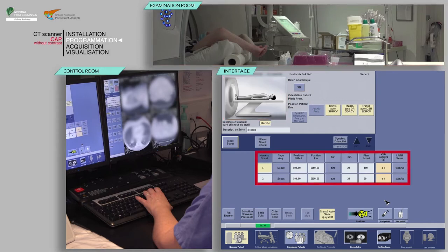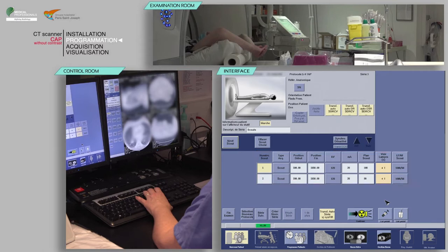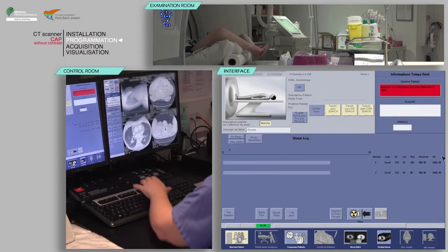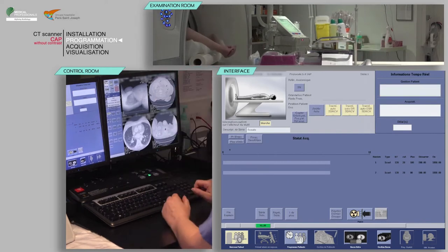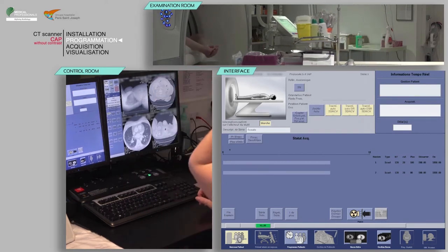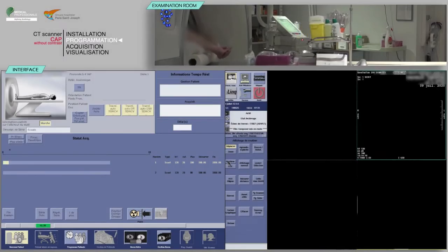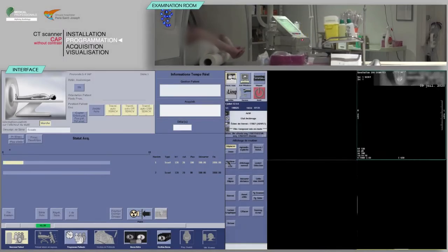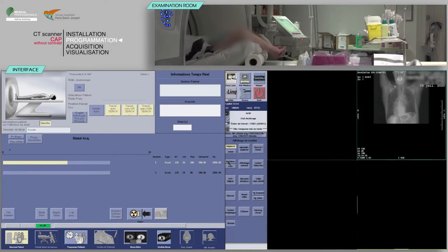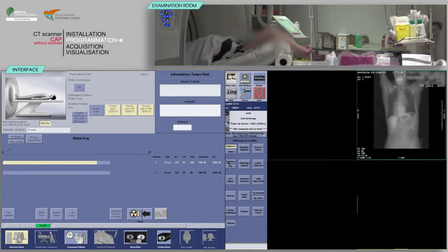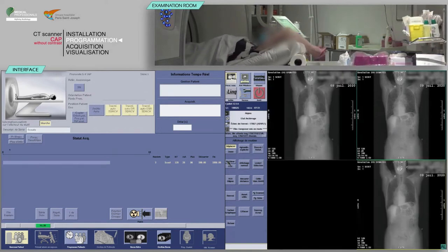After verifying the scan parameters, click on Confirm. Using the keyboard, move the table and initiate the acquisition when the buttons flash. Repeat to obtain a lateral view.